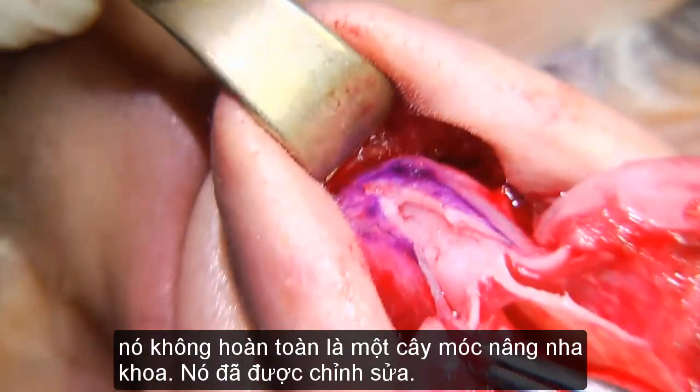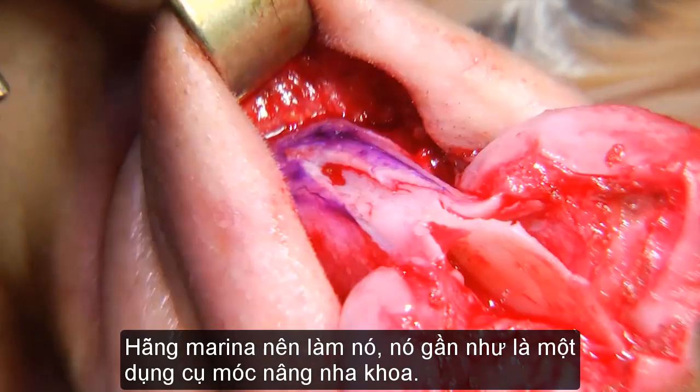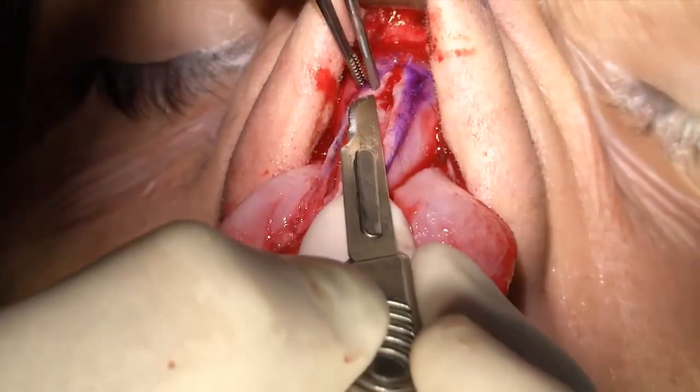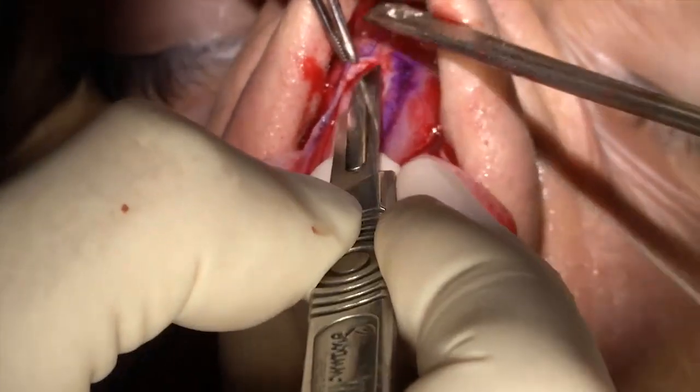It's not really a dental elevator, it's a little bit modified, but Marina Medical should make it. It's almost a dental elevator. So I am on the bone. You see I'm on the bone.